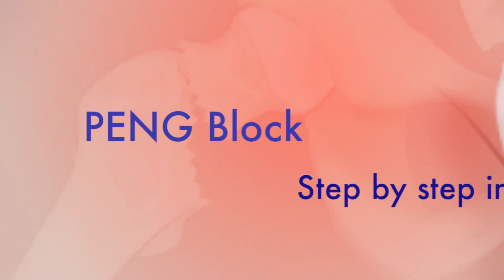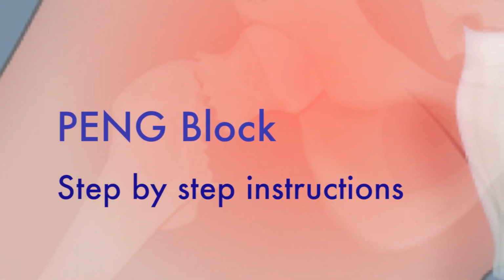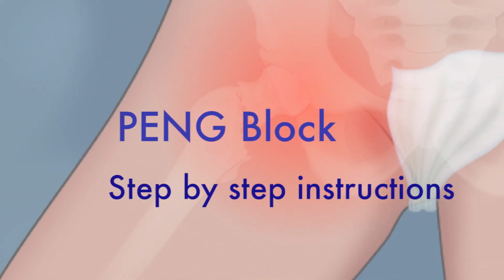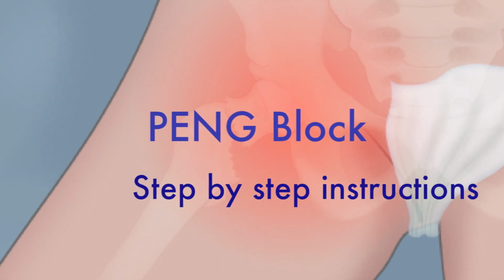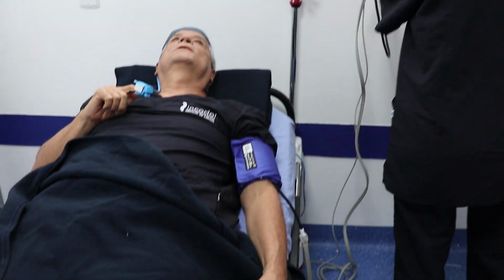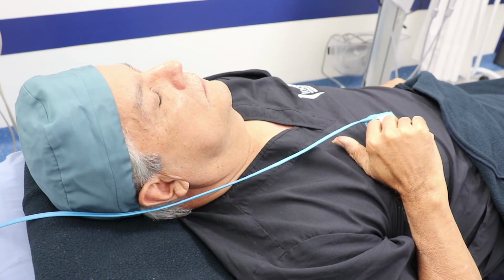Over the next few minutes, we will explain the rationale and technique of the pericapsular nerve group block, or PENG block, for hip fracture analgesia. We hope these step-by-step instructions will be of great value for improving your patient care.